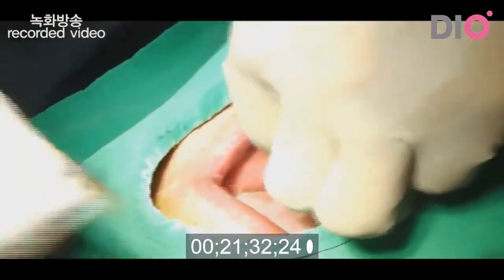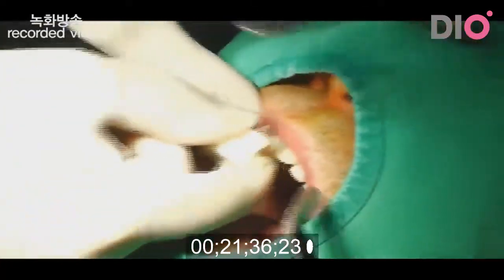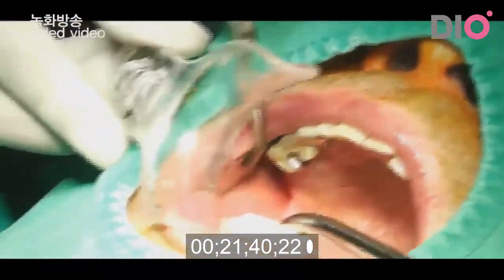I remove the connector and then suction. Crown, cover crown.